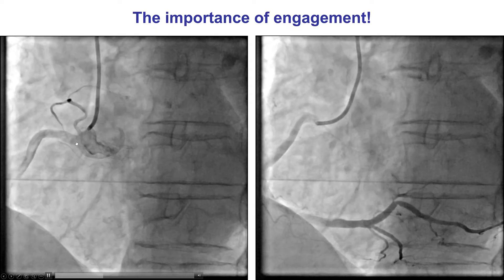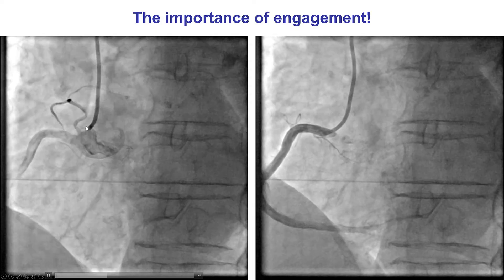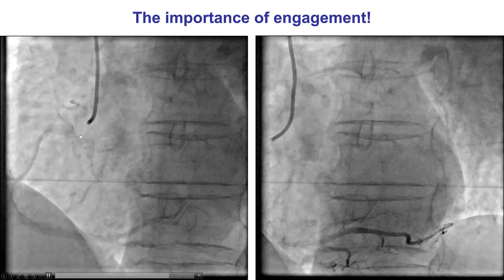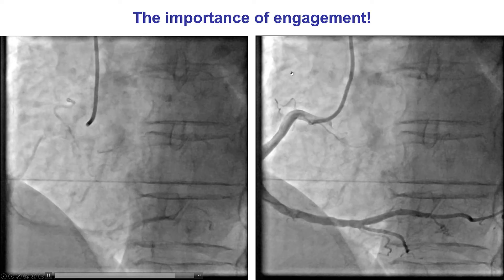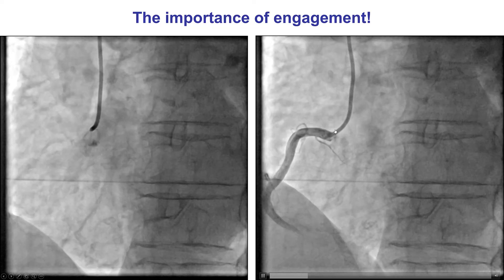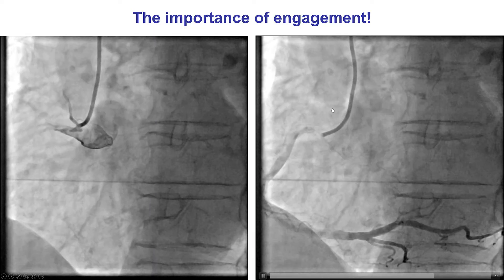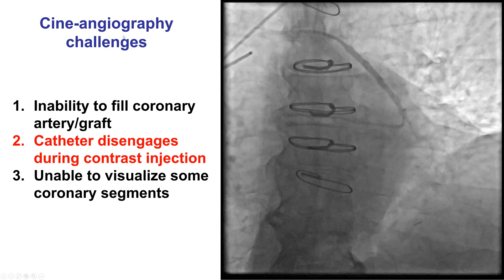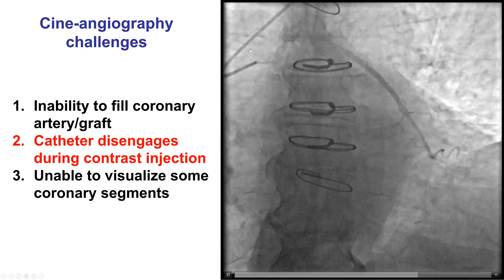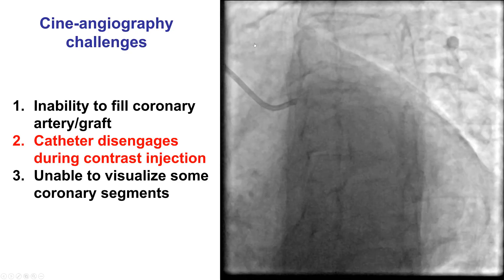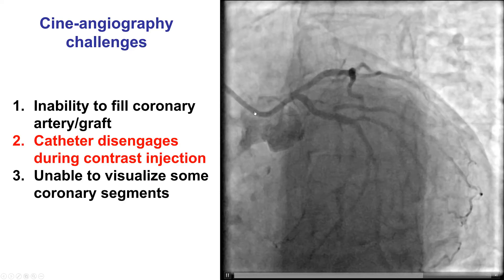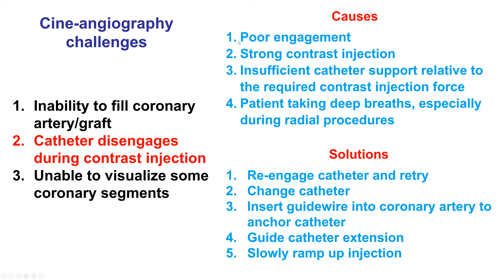This is an example of the importance of good engagement. On the left panel, the catheter is not properly engaged into the right coronary artery, so the angiogram is very suboptimal. On the right panel, the catheter is well engaged, and now we can well visualize the entire RCA as well as the ostium. A second challenge with cine angiography is disengagement of the catheter during the injection. There are many causes: poor engagement to start with, very strong contrast injection, insufficient catheter support, or the patient taking deep breaths. This is especially true for radial access.